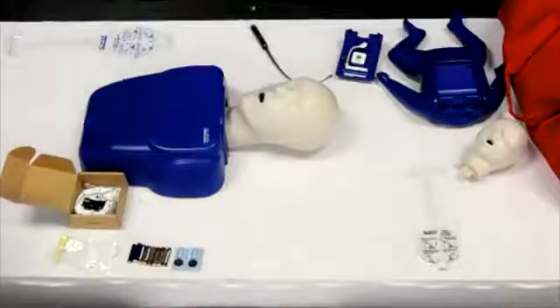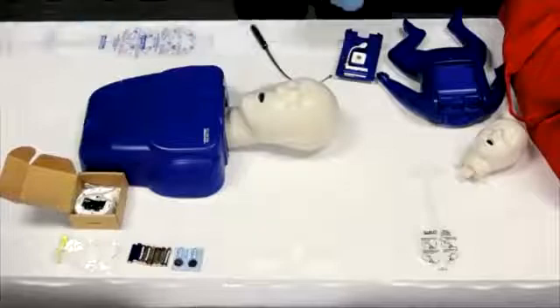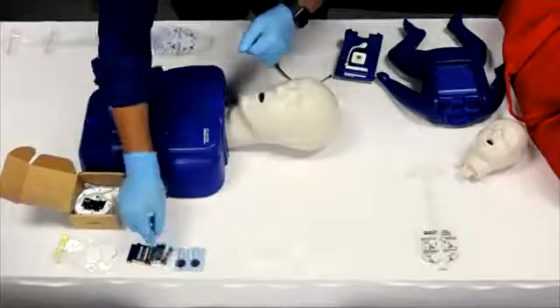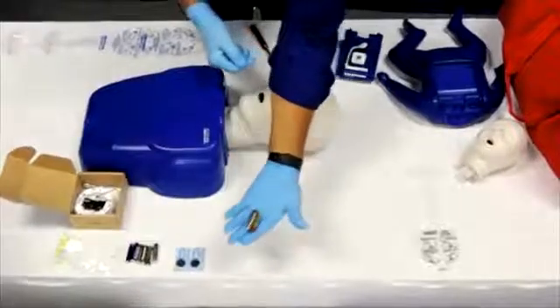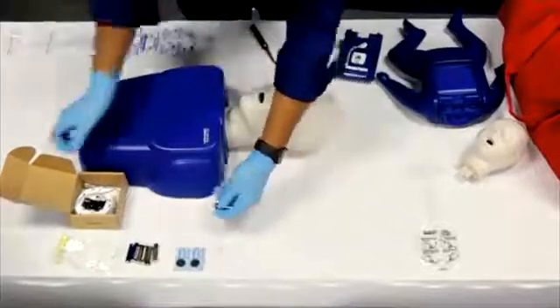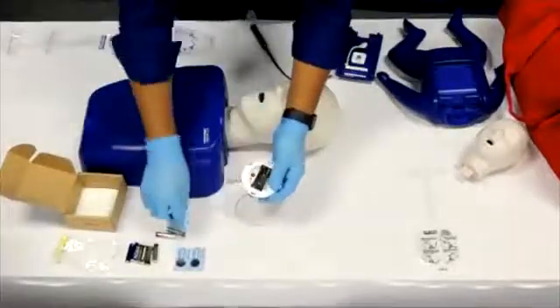Both the CPR Prompt Plus and Basic Buddy Plus require 2 AAA batteries to start the electronics installation. Purchase 2 AAA style batteries separately. Place the batteries in the battery compartment, paying special attention to battery direction.